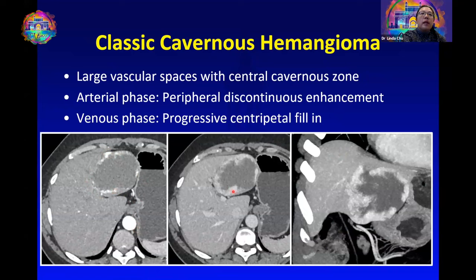On the venous phase images we expect to see progressive centripetal fill-in, and depending on the size of the lesion it may not completely fill on the venous or even the delayed phase images.